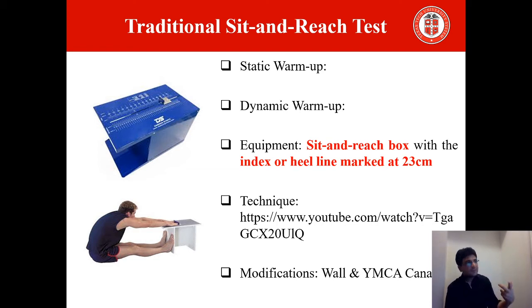As far as equipment is concerned, we have already talked, we need a sit and reach box, this blue box, and it has a mark of 23 centimeters somewhere here, where the feet are going to be put in this test. I have a YouTube link for the technique of how to do this test, but I will speak about it very briefly and will demonstrate it in the lab as well.